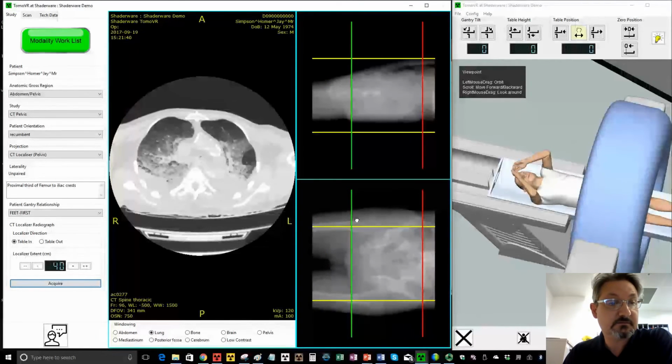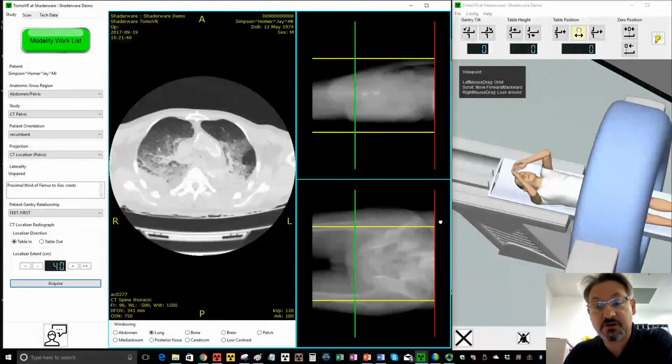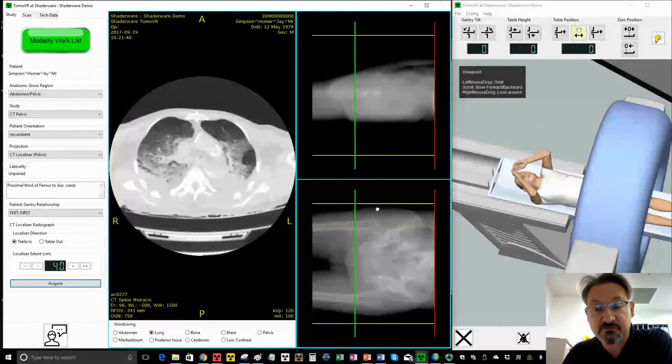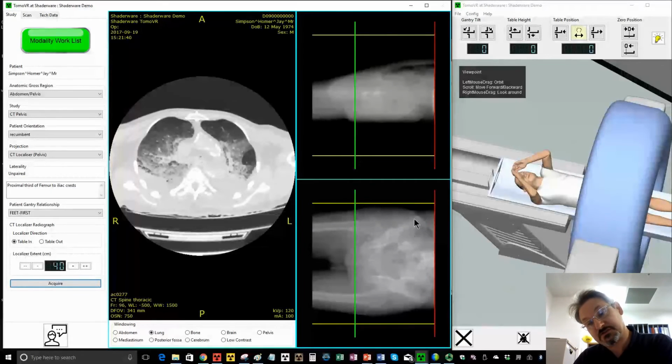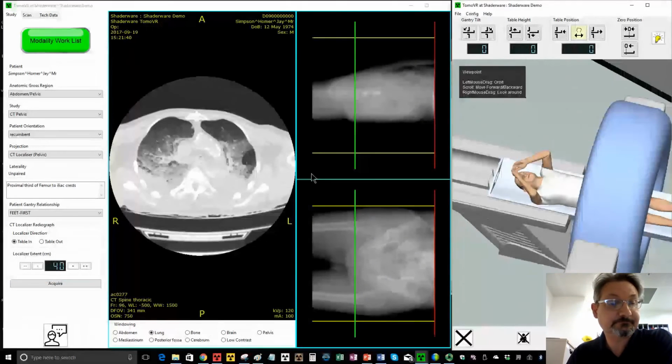So we just want the pelvis, and we want the full extent of the pelvis. So I'm going to move my start line. My green line is a start line, and my red line is a stop line. I only just got the crests on, look, so I'm going to have to put the stop line right at the top of the localizer. And I have my display field of view. I've not quite got him straight, so I'm going to have to use quite a wide display field of view just to make sure I get the crest on here. So I'm happy with that plan.